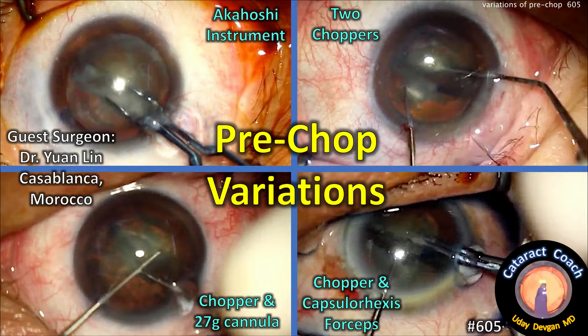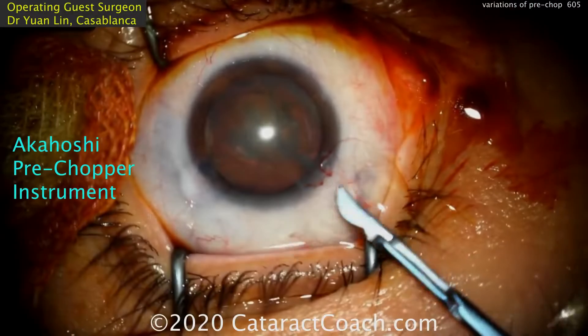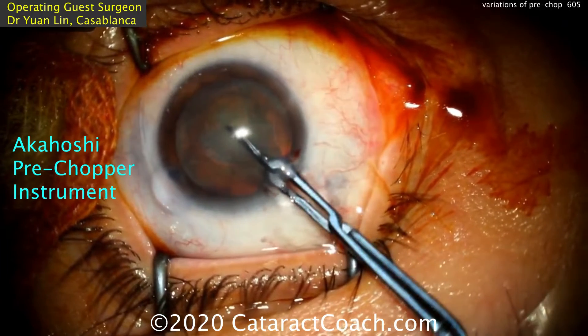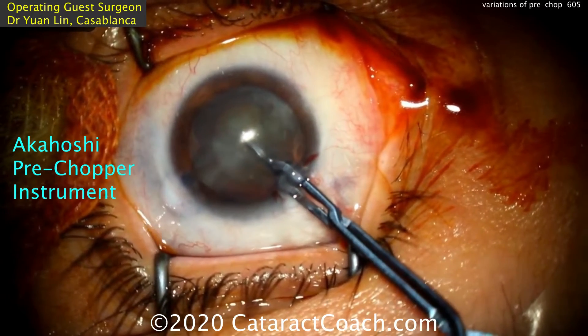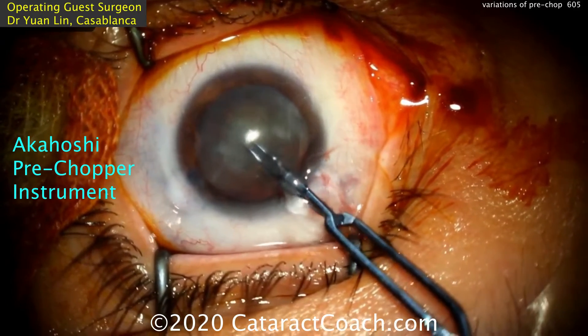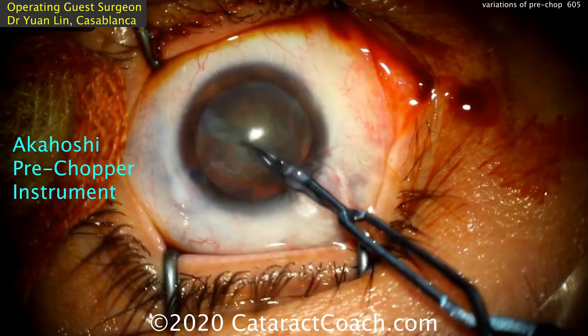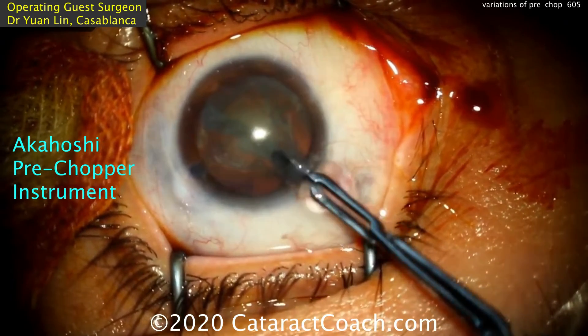CataractCoach.com. We've got pre-chop variations here. Guest surgeon Dr. Yuan Lin from Casablanca, Morocco. Here's the Akahoshi pre-chopper from Taka Akahoshi from Japan. With the eye full of viscoelastic, placing this inside the eye, you dig into the nucleus and it splits the nucleus for you.